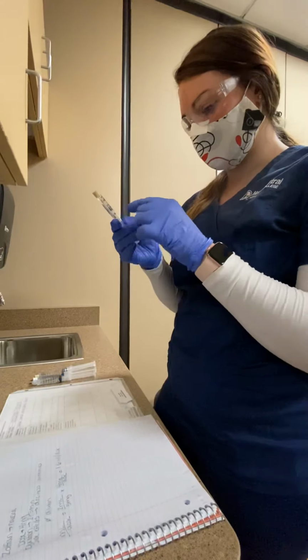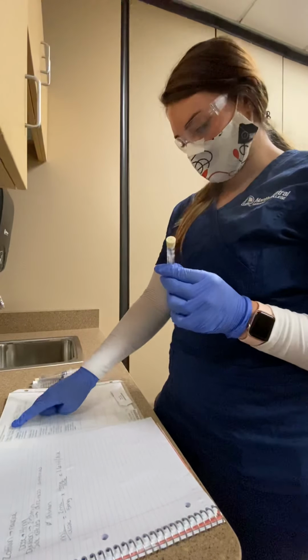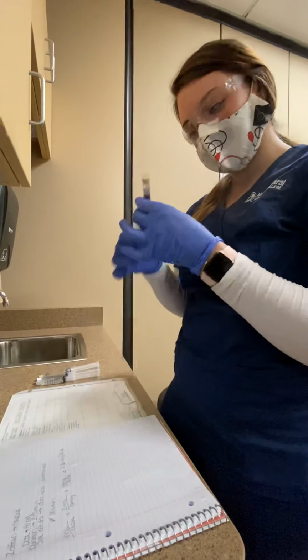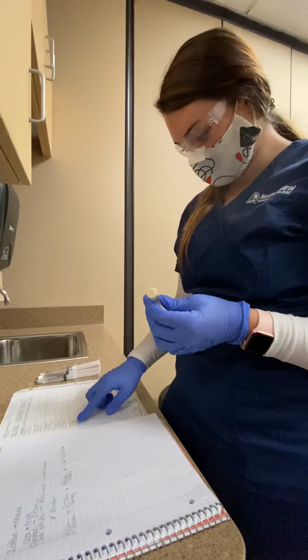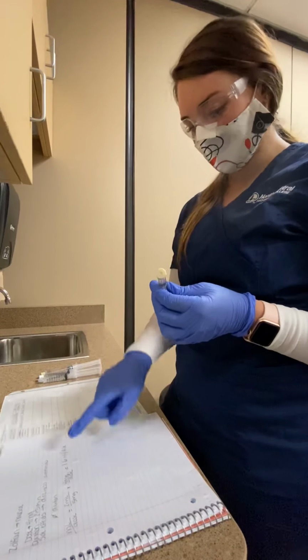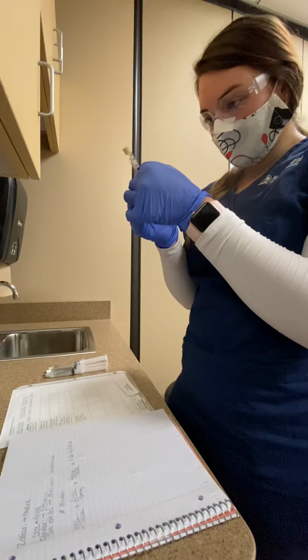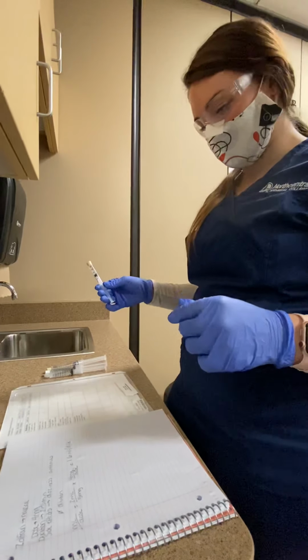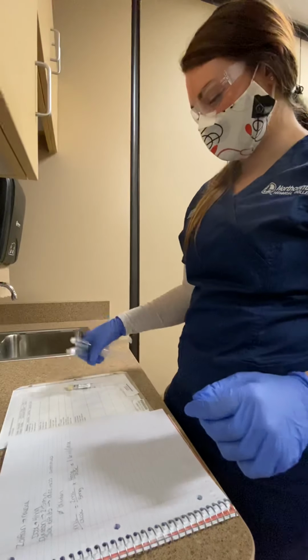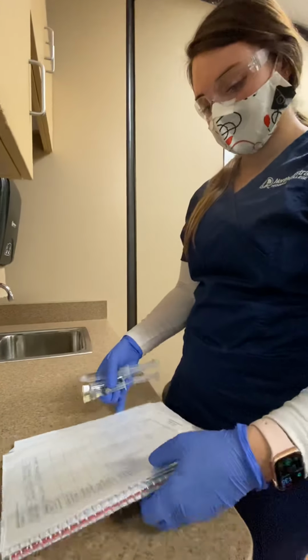1.6 milliliters. Mary Smith, morphine is her allergy. Zofran, 4 milligrams IV push every 4 hours, PRN, which is 1.6 milliliters. All right, we are dose accurate. So now I'm going to gather my supplies and go into her room.